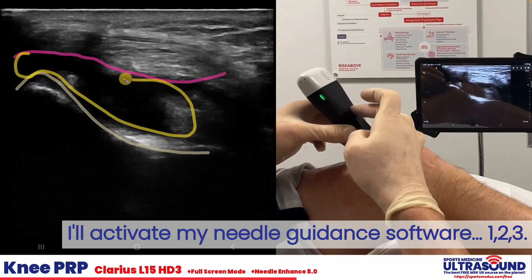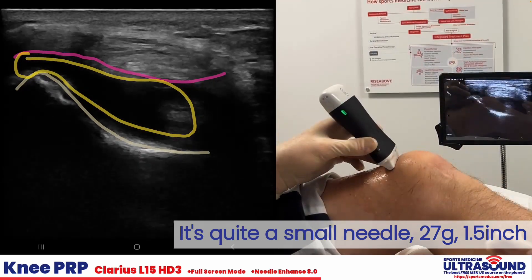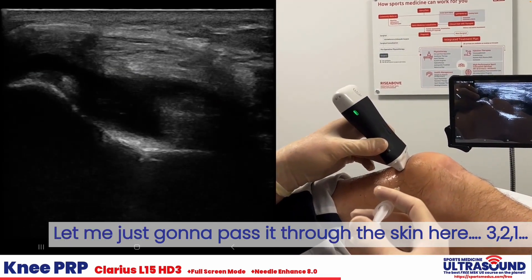I'll activate my needle guidance software. It's quite a small needle — it's a 27 gauge 1.5. I'm just going to pass it through the skin here.